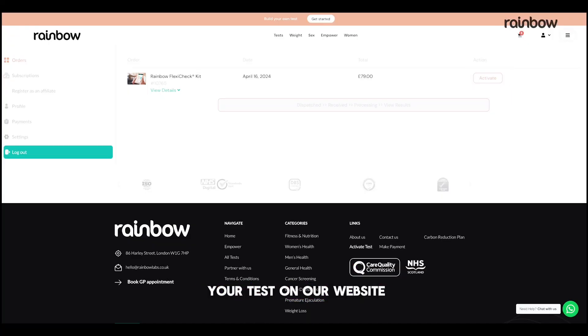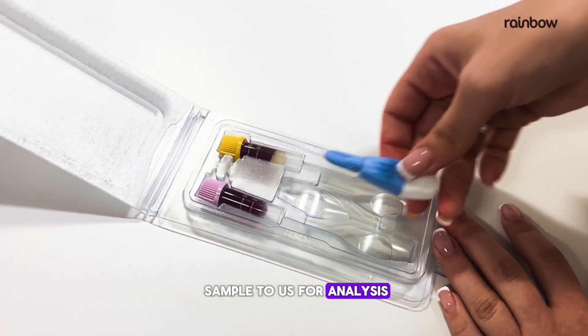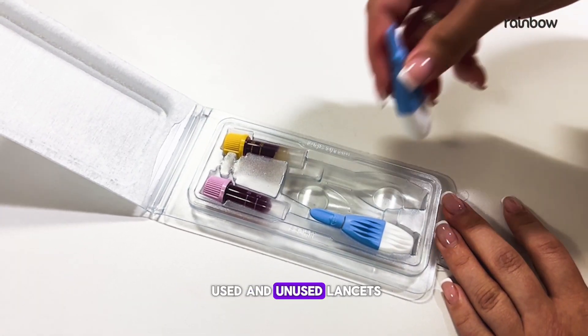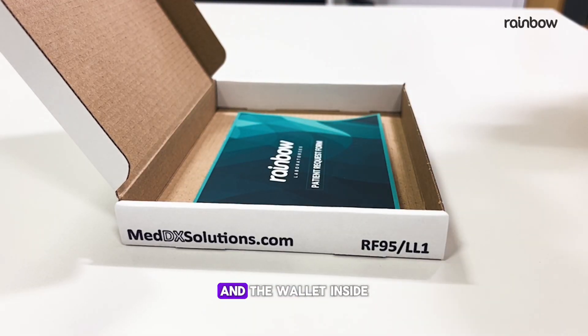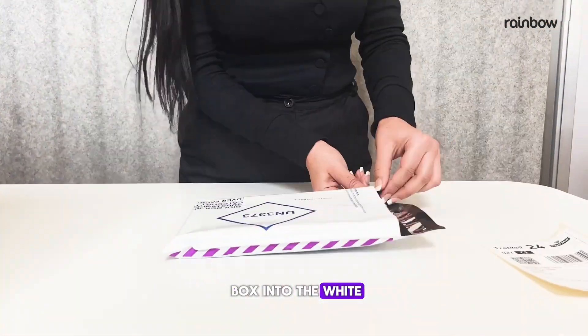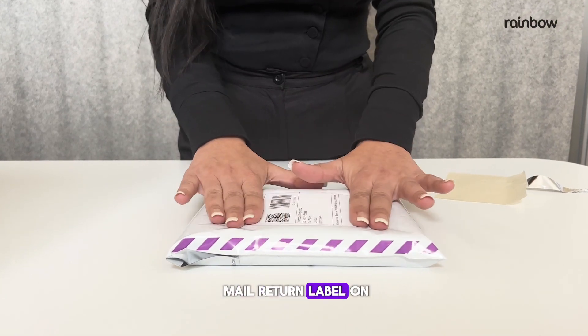Making sure to fill in your details clearly. Also, remember to activate your test on our website from your My Account page. You're now ready to return your sample to us for analysis. Ensure your sample along with all the used and unused lancets are securely placed in the plastic wallet — this is for safety and hygiene. Then place the request form and the wallet inside your kit box, and put the kit box into the white bag provided.